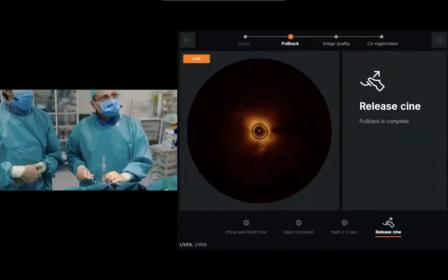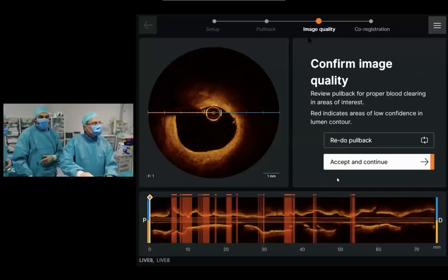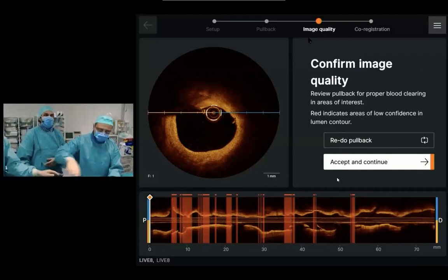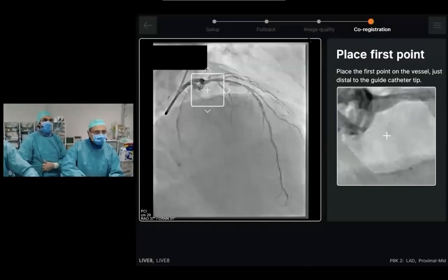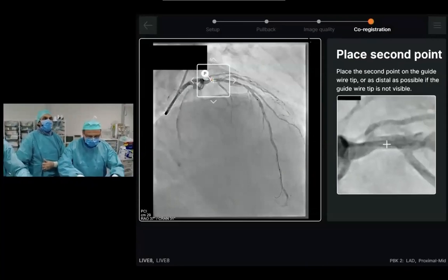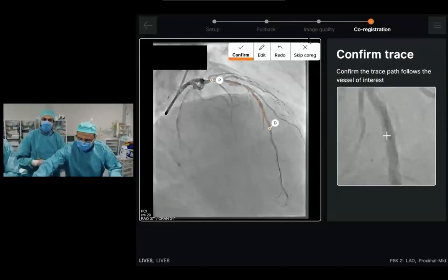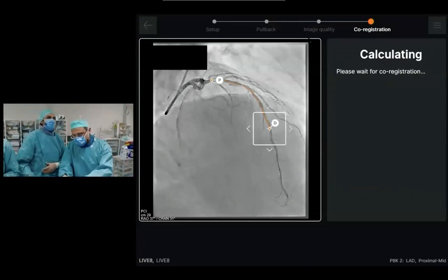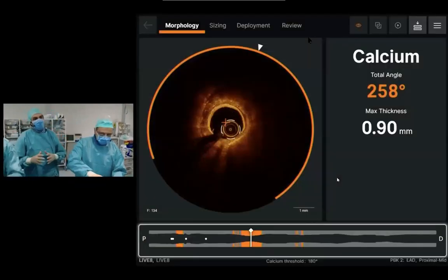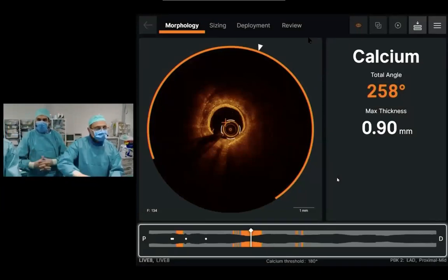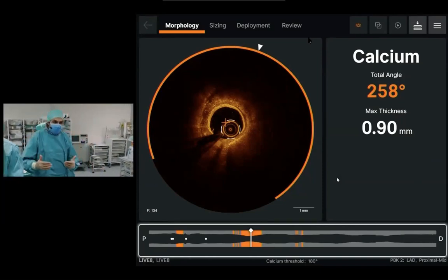The first step in this new layer of the software is to accept the quality of the pullback — I'm going to accept and continue. The next point is to inform the system where is the vessel to perform the co-registration. I'm going to put a point in the proximal part of the vessel and another point in the distal part. We check the center line goes in the path that we have selected — this is correct. I'm going to confirm now and then the co-registration is being performed.